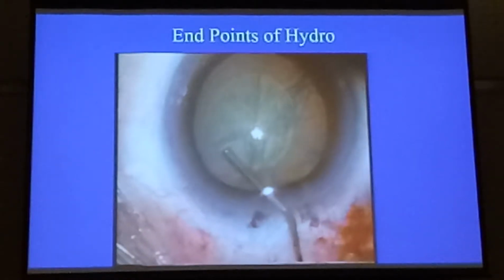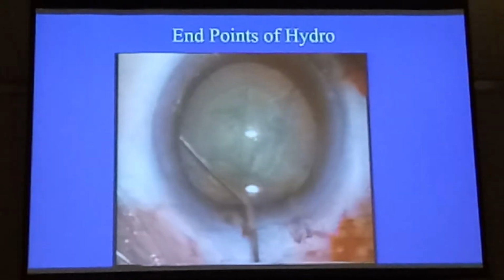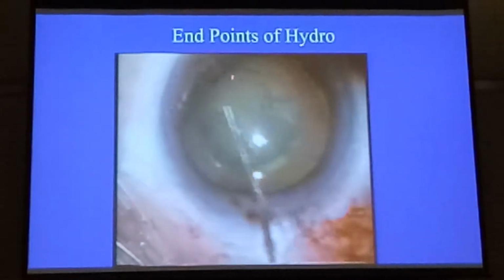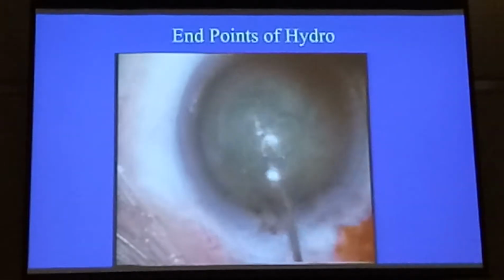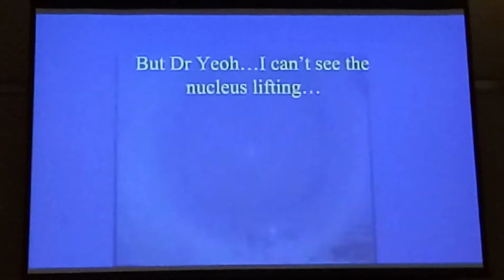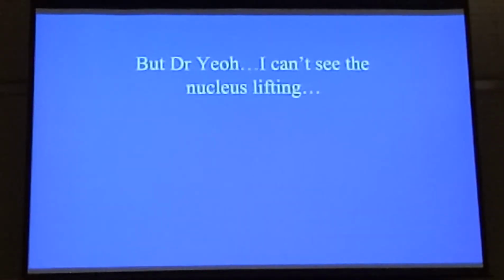So let's do it again on the other side. You'll see the wave, that's the wave, that's the lift. And in this case, you see that the whole nucleus prolapses out of the bag. So those are the three signs I showed you earlier. But you know, my residents are quite difficult in Singapore. I tell them, see the nucleus lifting? They say, no, I don't see it. It's not there. What they mean is I'm talking rubbish.